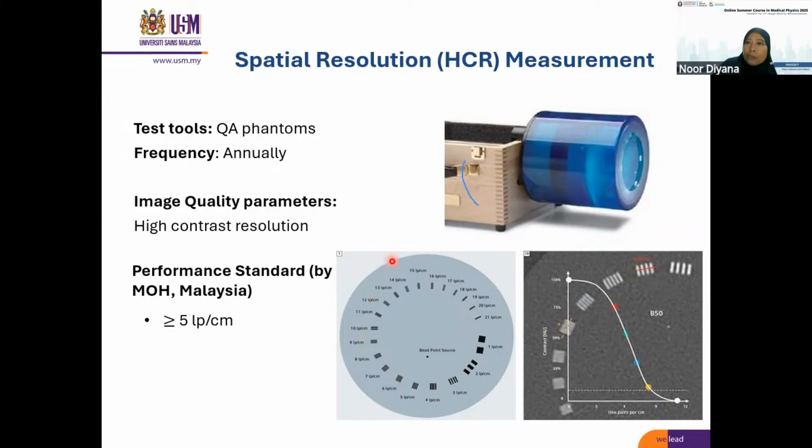Okay, so this is based on my experience. Sometimes we tilt the phantom, and then you can't observe all the line pairs on the same slice thickness. So you should properly position your phantom. That's the first step for the measurement, and it depends on the expertise of the physicist. Usually for the CATphan, there will be a box, and you put it on the box, and you have to carefully measure so that it is correctly on the laser light.